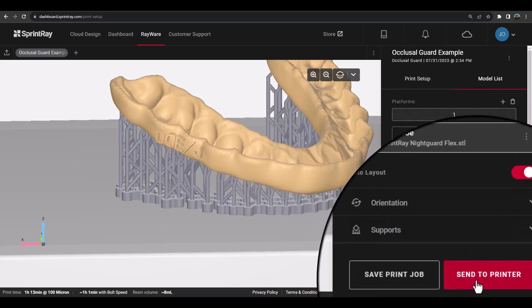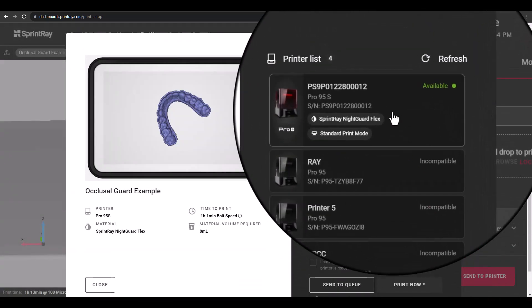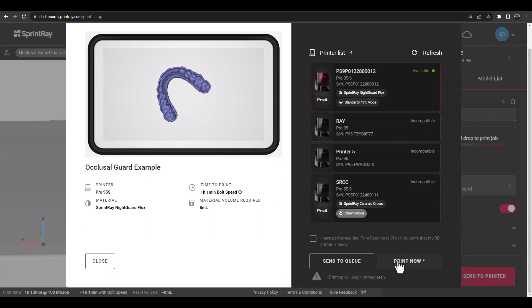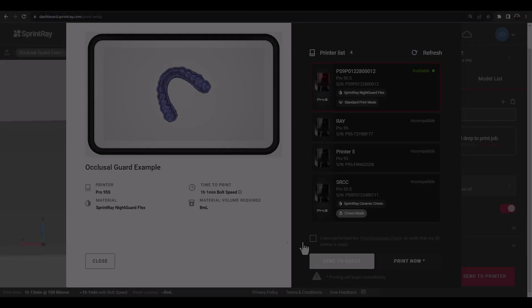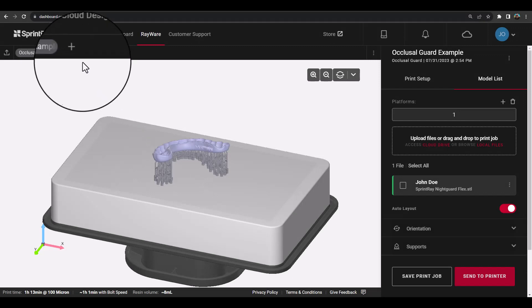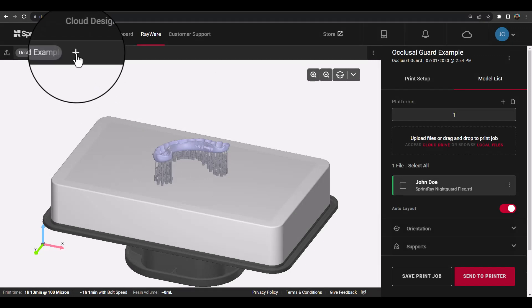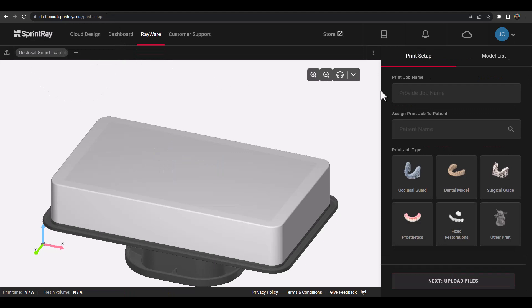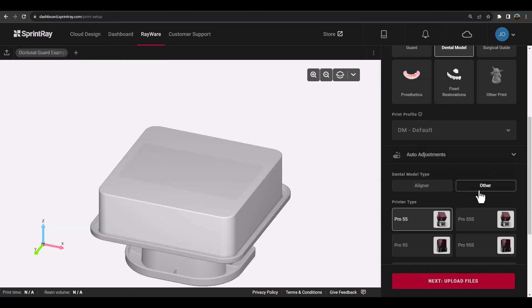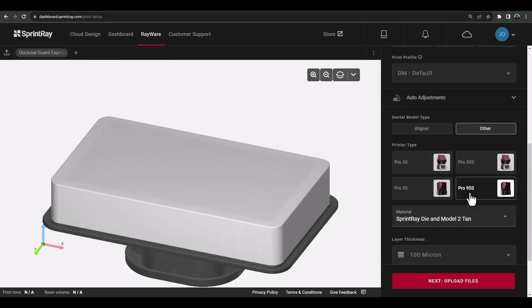Once your models are ready, click the Send to Printer button and Rayware Cloud will show all of the connected printers using the same dashboard account that are compatible with the print job. At any time, you can add additional platforms by using the platform ribbon at top — click the plus icon and then choose your appliance type and print profile.